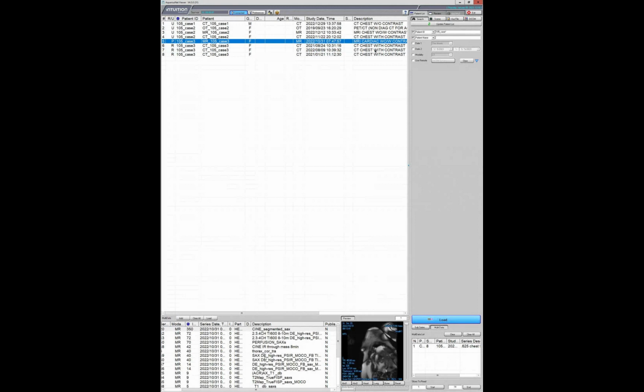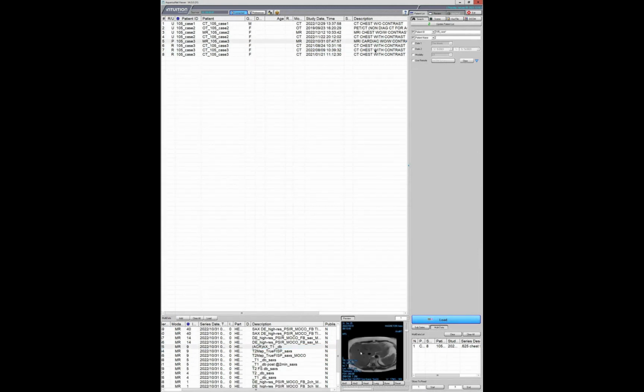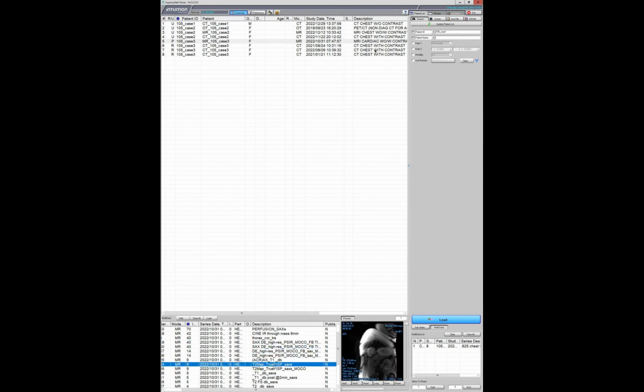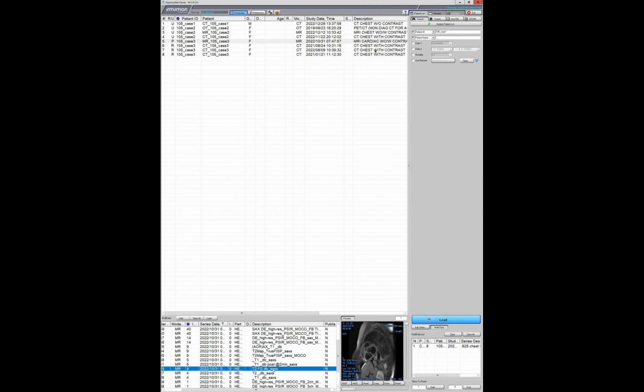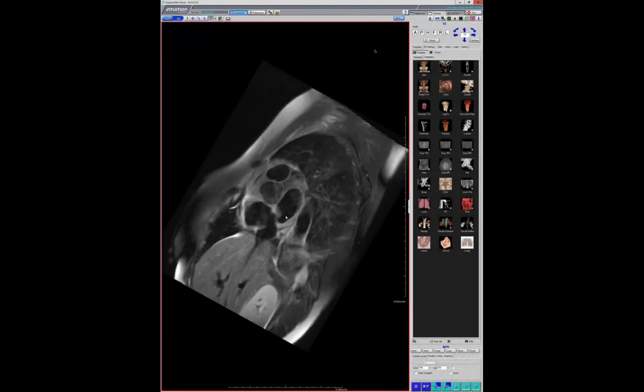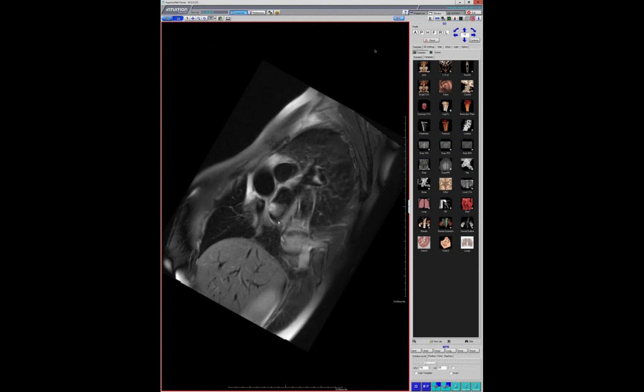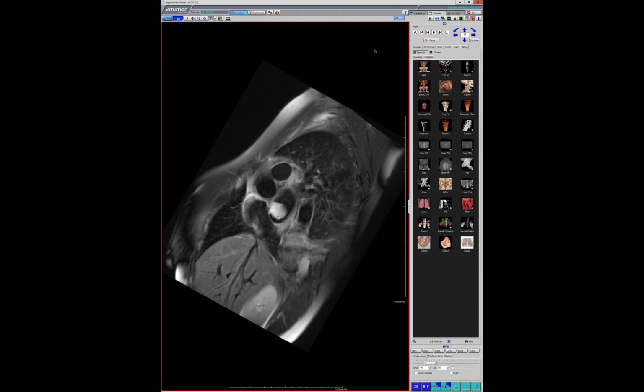And this does turn out to be a myxoma. We've done cardiac imaging, see a fair number of myxomas, and they're obviously tumors. I'm just trying to see if I've seen one grow this quickly. One thought was that maybe there's a lot of clot associated with it, but this is very T2 weighted imaging, and it's mostly fluid because these are highly cystic tumors. That's the myxomatous elements. On the path, they talked about a little bit of clot on the edge, but it was a 2.5, 3 centimeter mass, and it was myxoma.